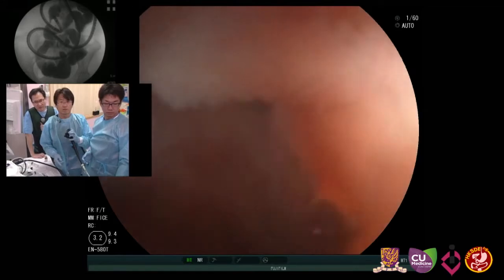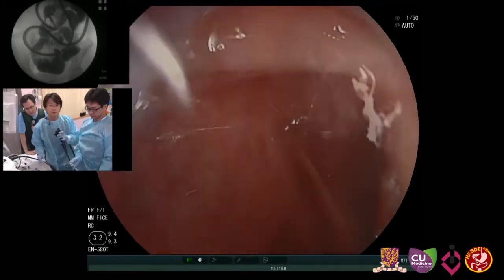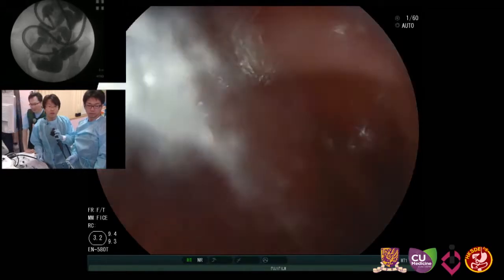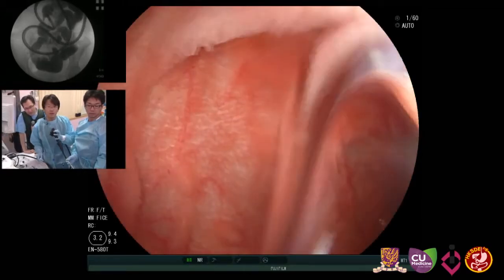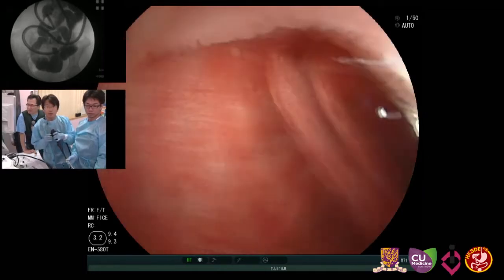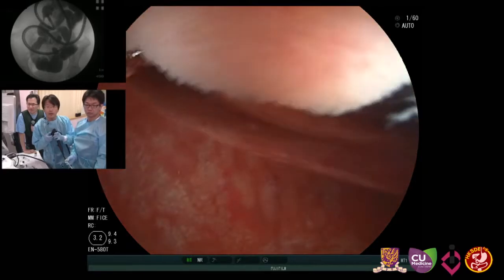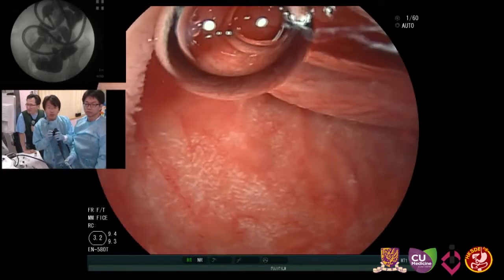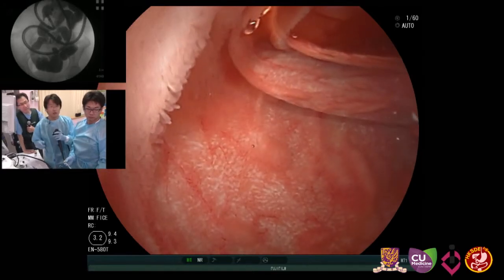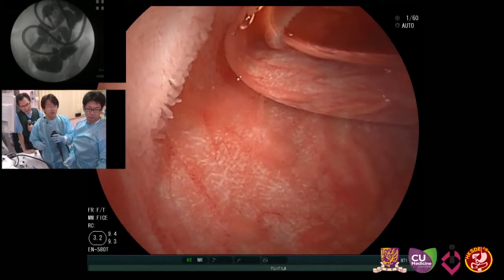Dr. Yamamoto, I can see you may have some finding, right? You have gone deep into the small bowel. Yes, and now you can see the inflammatory changes, inflammatory polyps and scars, but no active ulceration so far. And I came deep enough. Here I use the contrast, and I want to show you the X-ray image.